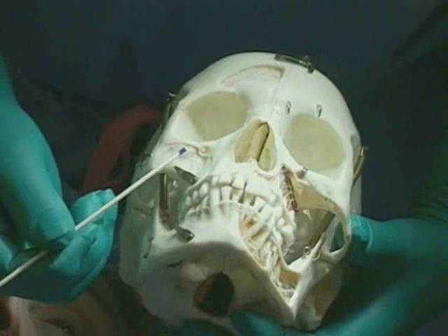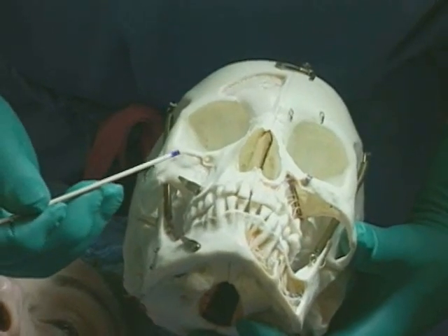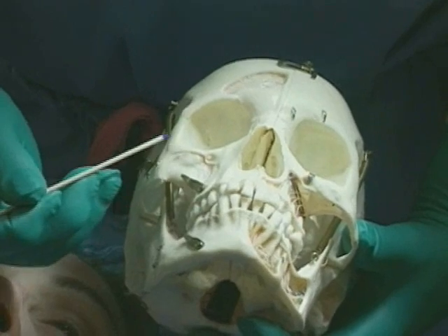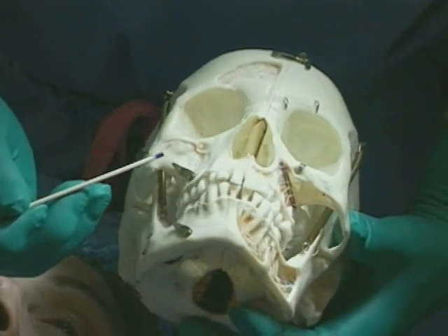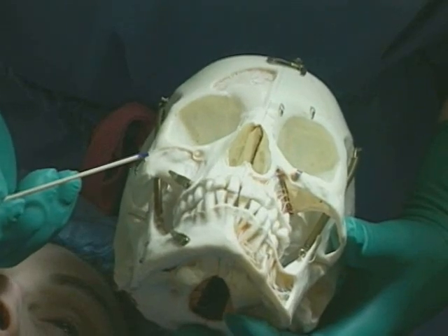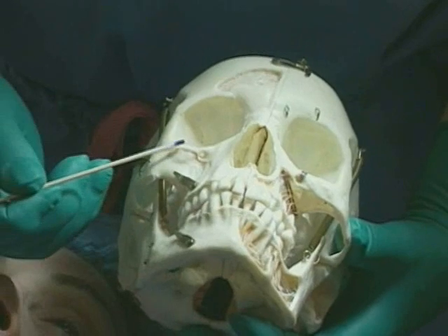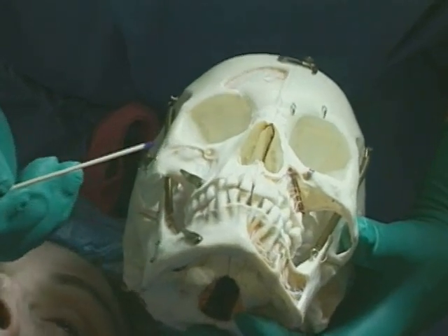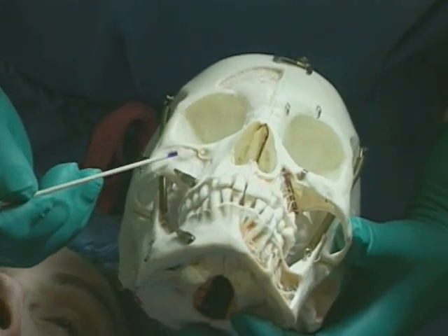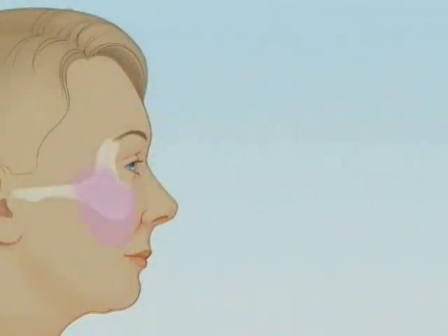Okay. We'll elevate in a subperiosteal plane over the zygoma. We want to free up the attachments at the arcus marginalis, and also we know that the zygomaticus major and the zygomaticus minor attach to the periosteum and are confluent with the periosteum above the infraorbital foramen and along this orbital rim. So we want to elevate over in this area.